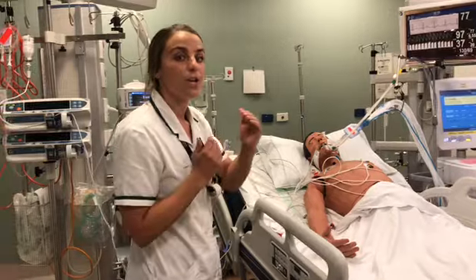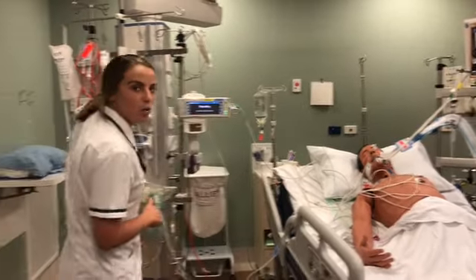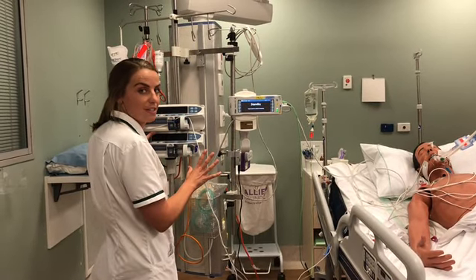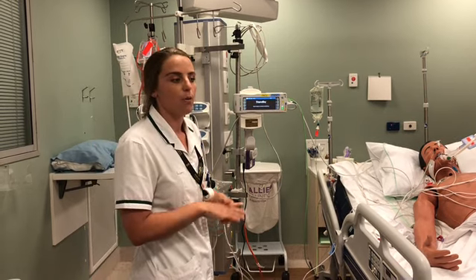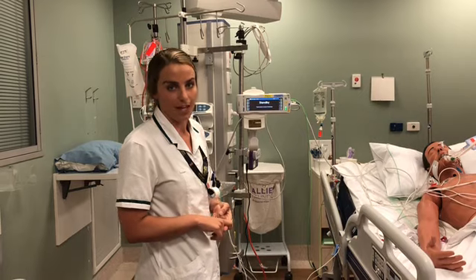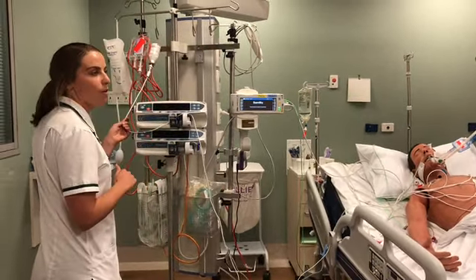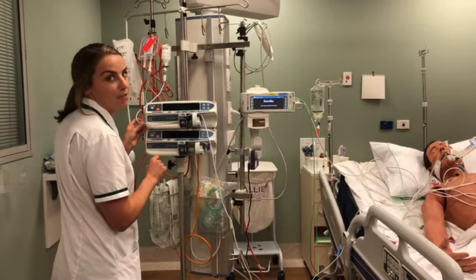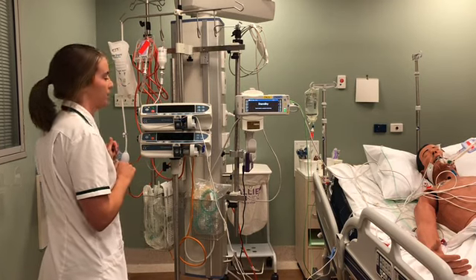Alright, then we'll work as a team to finish our daily plan. I will call out the levels of our infusions and when they're due. This is a safety measure so that when we move away from the bed space, we know how much time we have left. Alright, Michael, so we have propofol running at 20 mils an hour. We have 40 mils left in the pump. So on our plan, due in 2 hours.